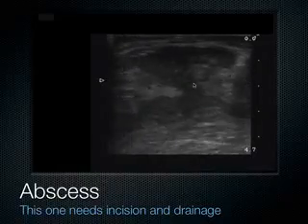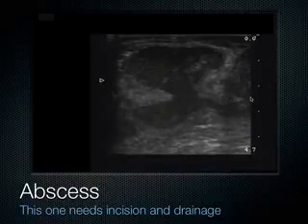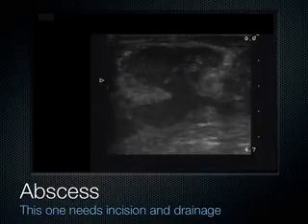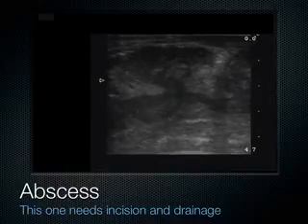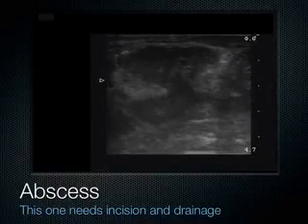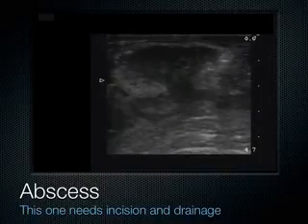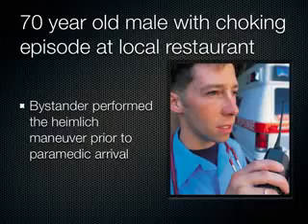Sometimes you can see how they have lots of other islands underneath that connect up, and if the abscess is large enough, you may even consider referring some of these to surgery if they have a lot of pockets and things that would require lots of invasive drainages. So this is one way that can even help disposition the patient.